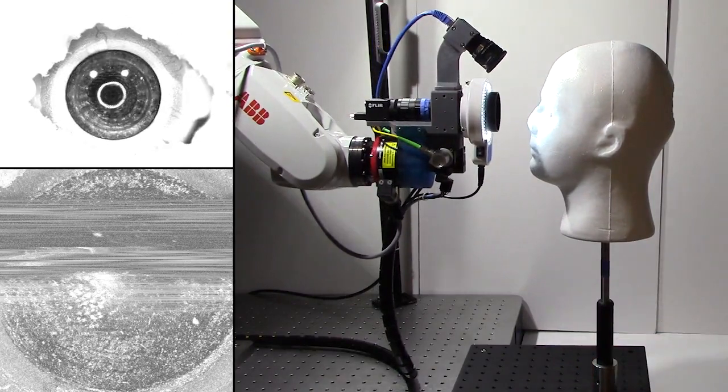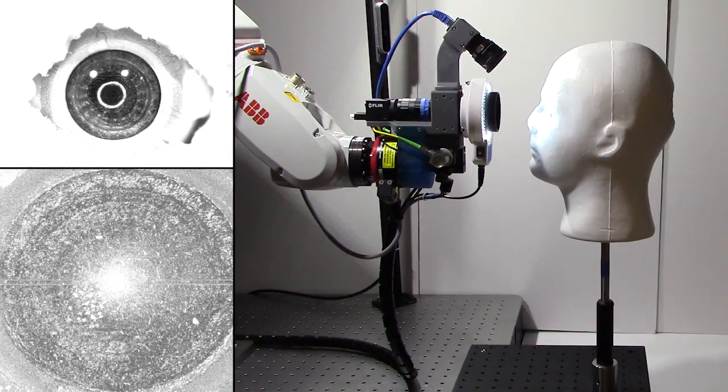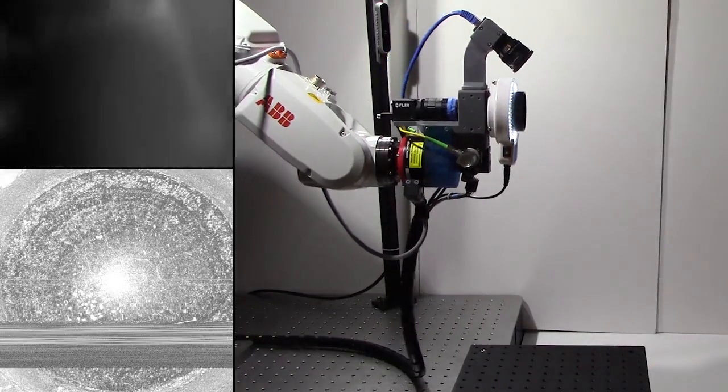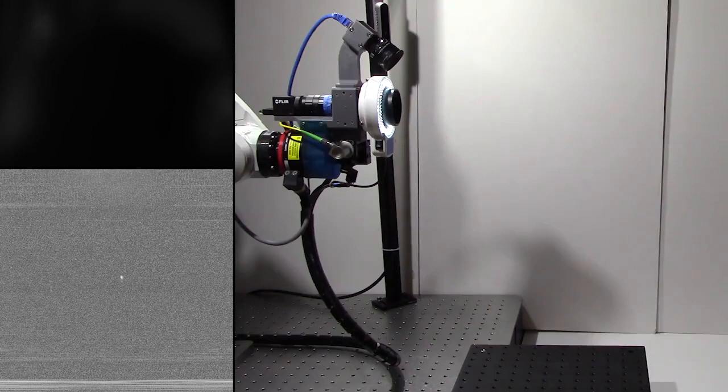The scanner continues tracking the eye even if it moves. When the eye is withdrawn such that tracking fails, the robot returns the scanner to its start position.